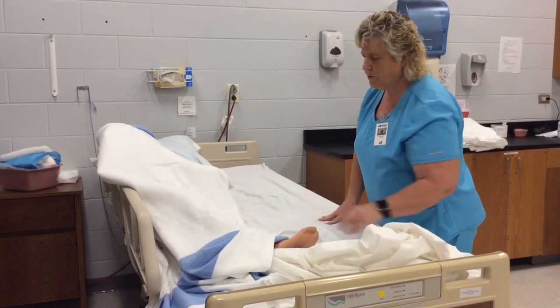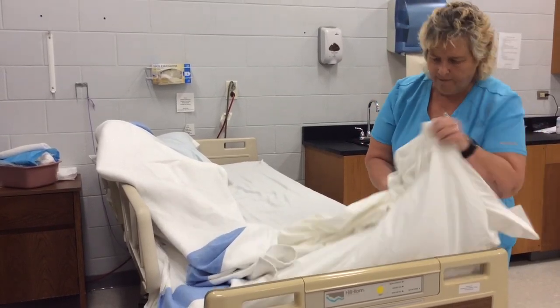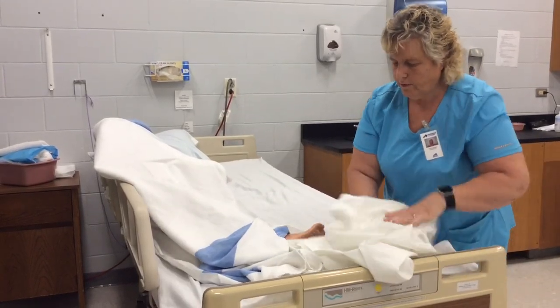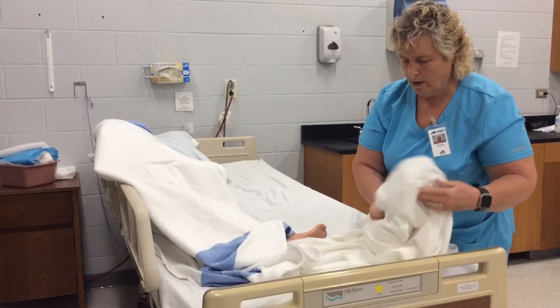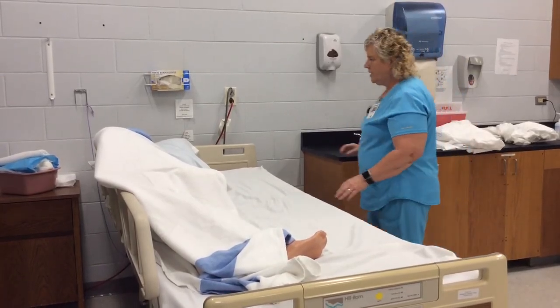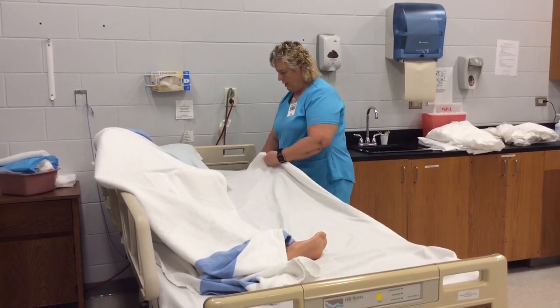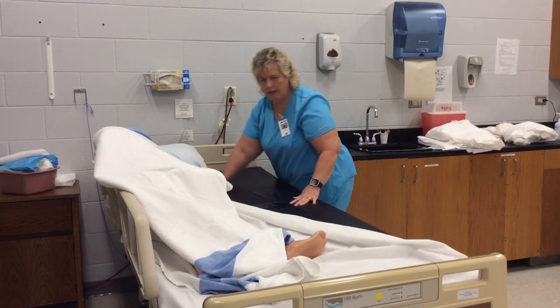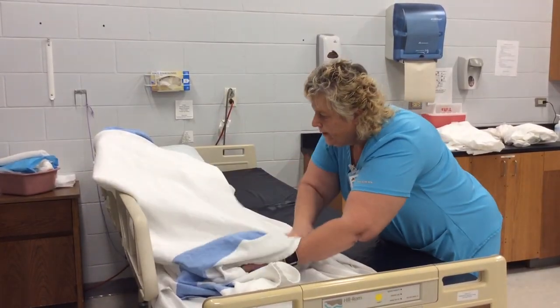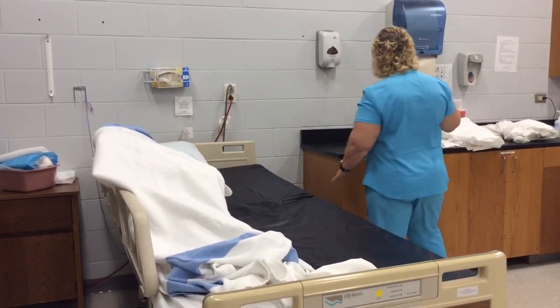And then the first thing I'm going to do is go ahead and loosen the bedding, if I hadn't already done so, and take this top sheet off. And you could have done that when you put the bath blanket on, and that will go in your hamper. So then I'm going to take the bottom sheet, and I'm going to roll it up all the way next to her, and that way I have this whole bed to work on.